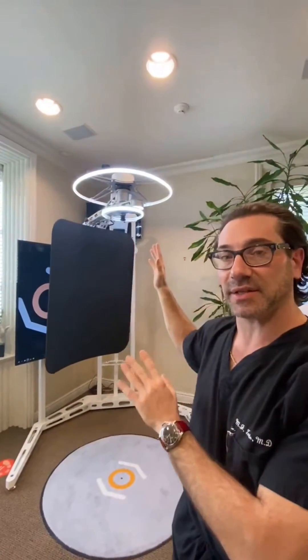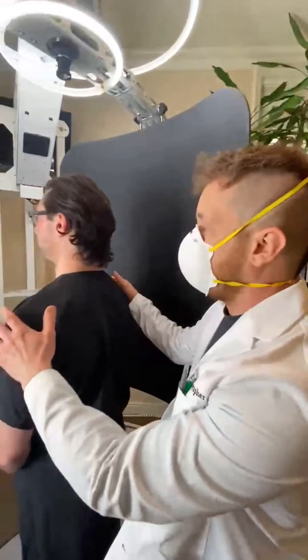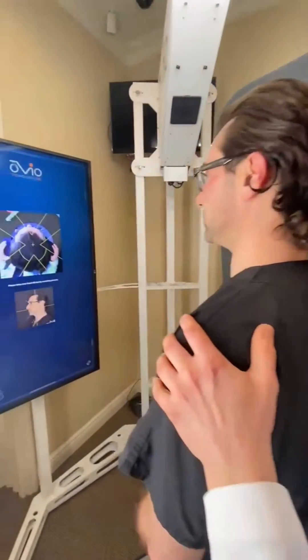This is OVIO — the apparatus behind me here. This is the latest, state-of-the-art in photographic and video technology for before and after from surgery. Richie over here is going to help us set this up and we're going to give you a quick tutorial, aligning the patient and the coordinates that it needs to be set.